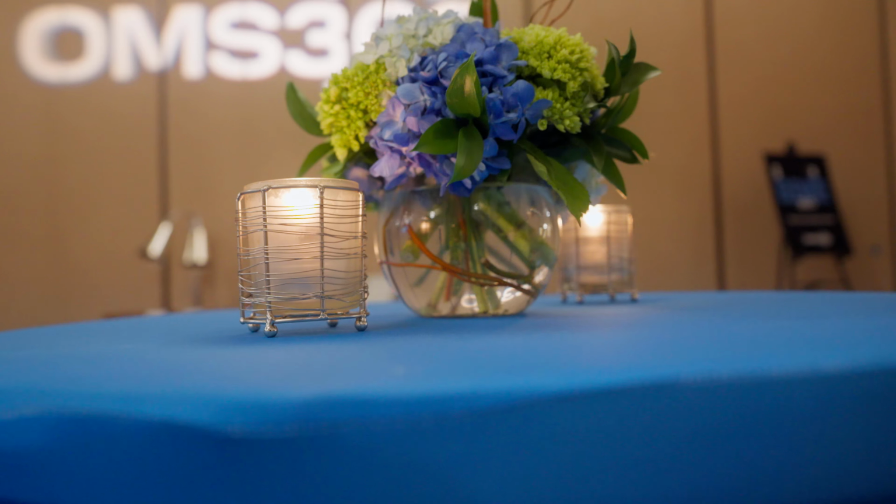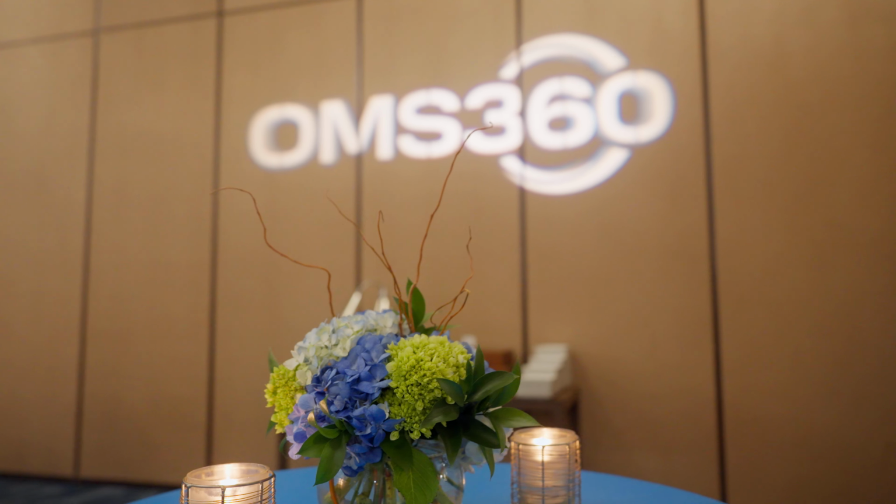The biggest differences between the digital approach to all-in-4 and the conventional approach to all-in-4 is that we are really working more hand in hand with a lab before surgery. Our lab comes to the office with us and helps us to do photogrammetry, three-dimensional photographs, and our CT scan, our intraoral scans. All that data is acquired, shared with the general dentist.